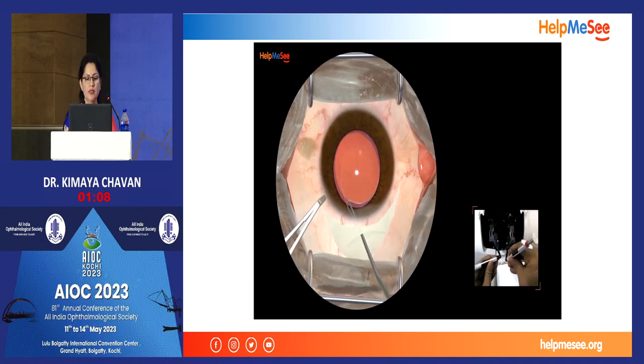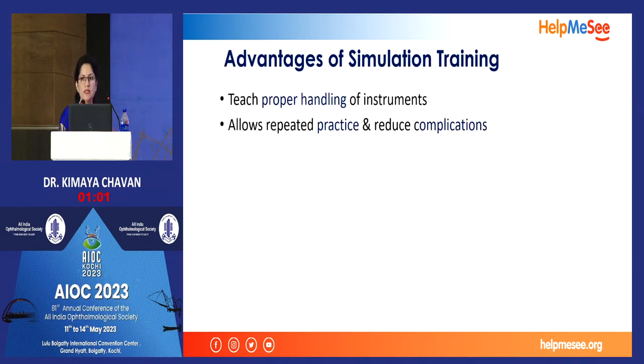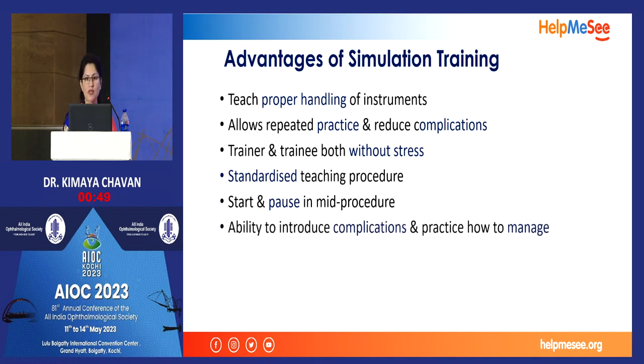Now, there are many advantages of simulation training. As I told you before, we can start from handling of the instruments, and students can practice repeatedly, which we cannot do in live surgery. Here, teacher and students both are without any stress, because when you are teaching on live surgery, even we are stressed, right?